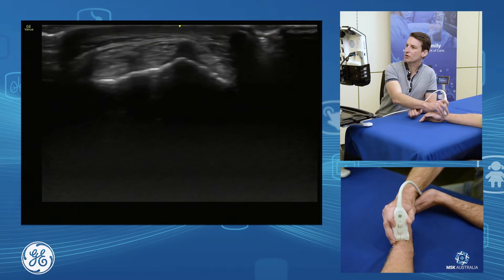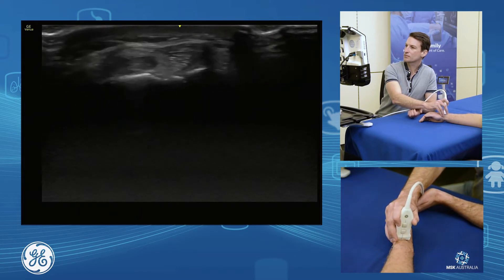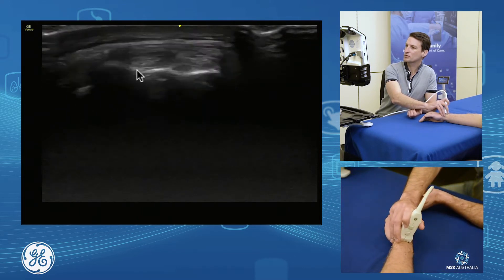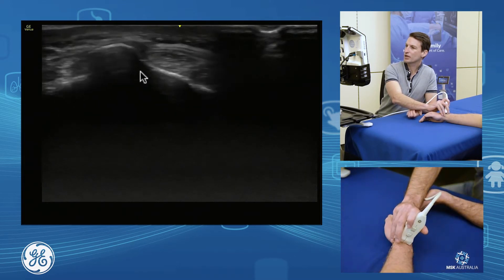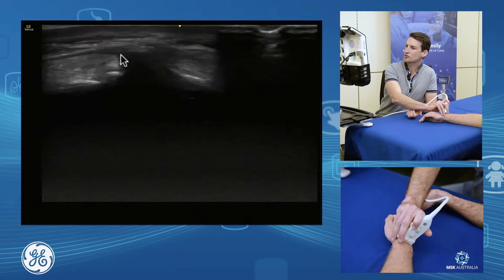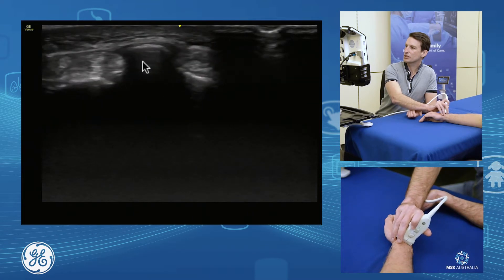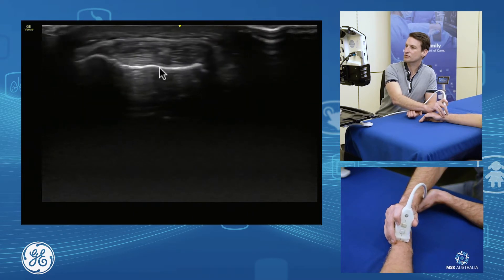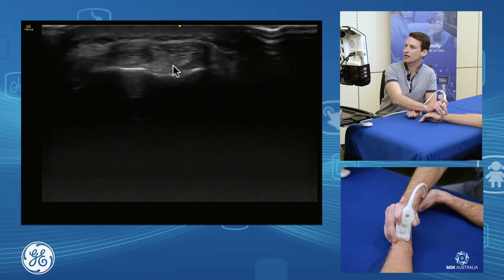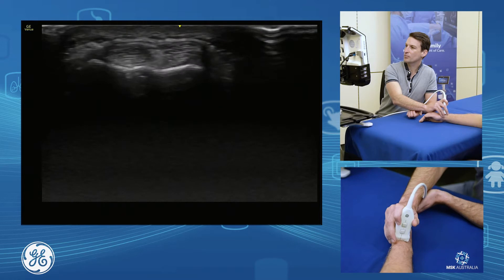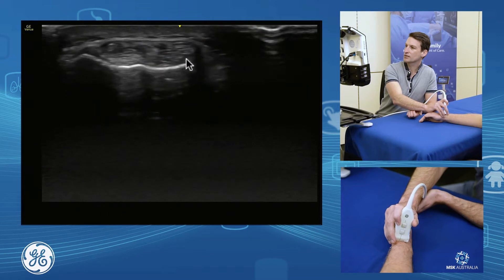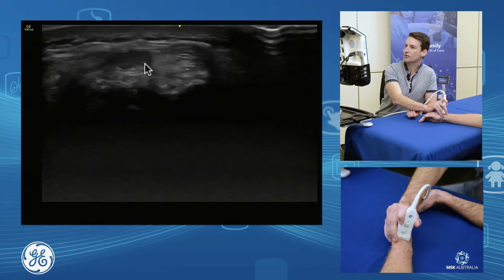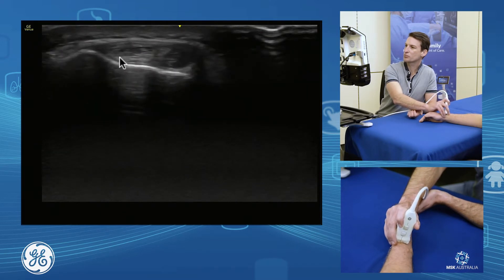As we roll around, we fall into compartment two. We have our Lister's tubercle sitting here. Compartment two sits on the lateral side, and that's our extensor carpi radialis longus and extensor carpi radialis brevis.